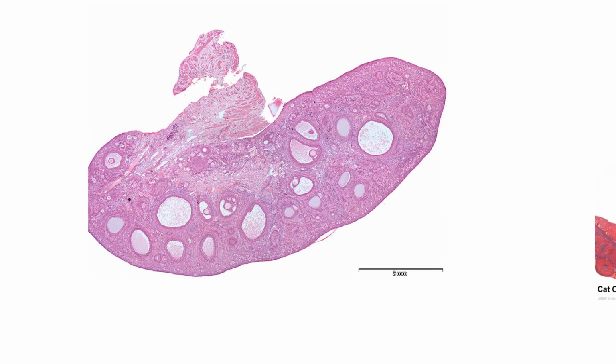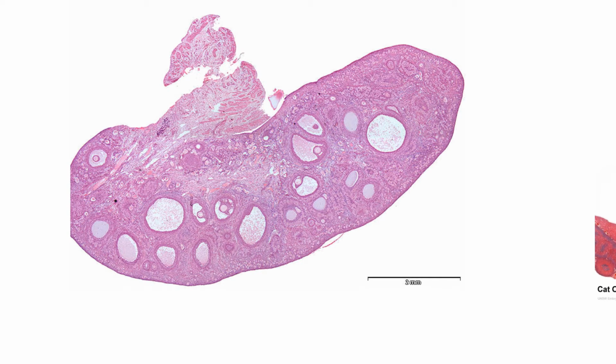But look at this. This is a whole cat ovary, basically. So good. Here's one end, and if you followed it, it might be missing a little bit, it looks like, but it would probably be like this. So that's almost the entire cat ovary, feline ovary. Every open area is a follicle, okay? And every follicle has one egg. Like I'll make the egg right here red. That's an egg inside a follicle. There's another egg, another one.